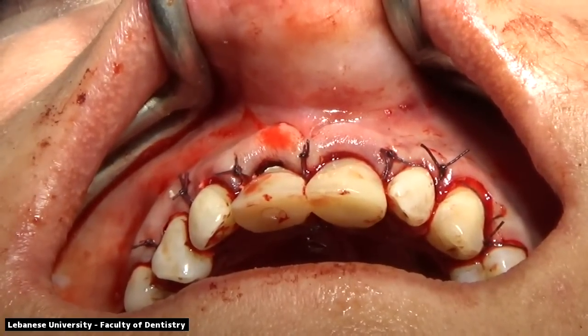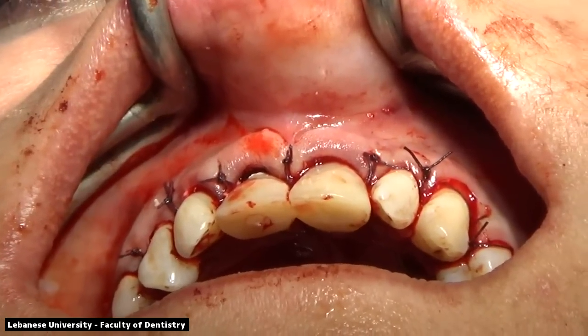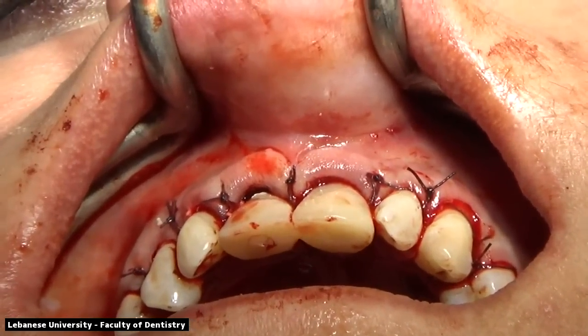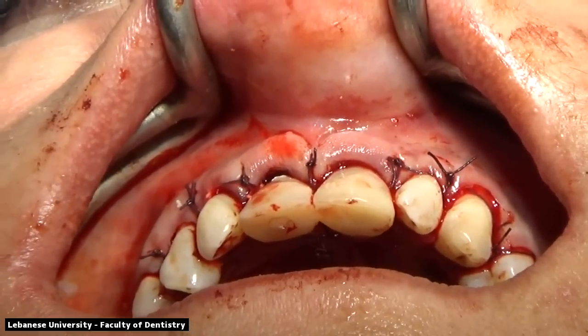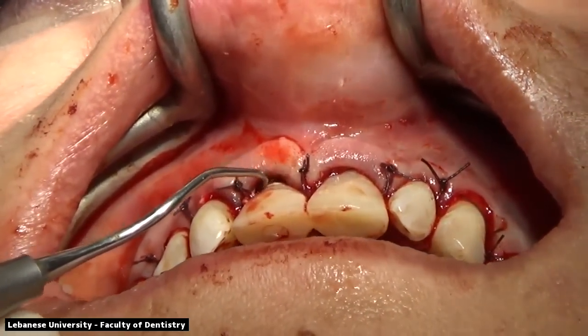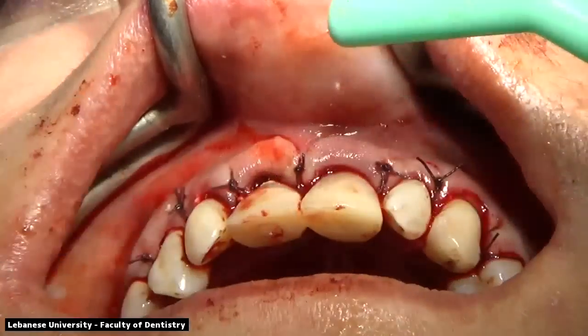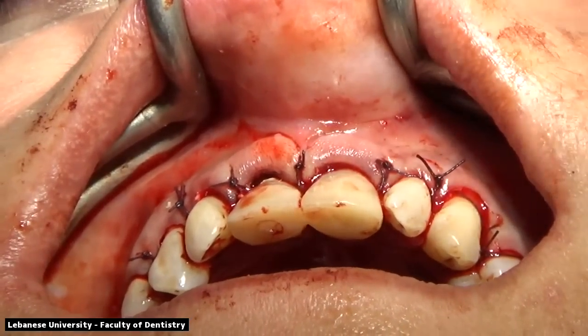There is some slight cement on the right central incisor. Bone graft? Okay. Just making sure that this is resin and not temporary cement. So this is from the resin material. It's completely adaptable. There's no excess cement on this site.